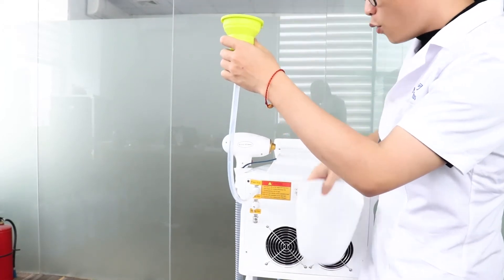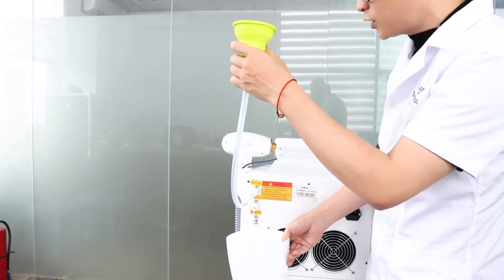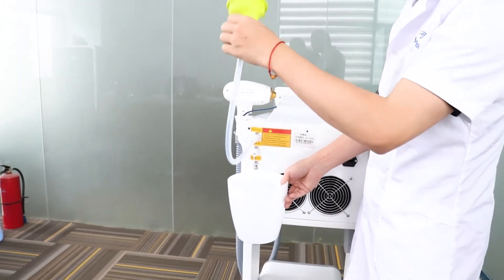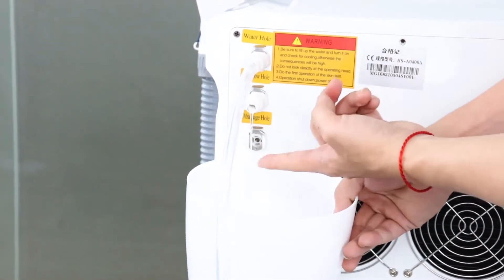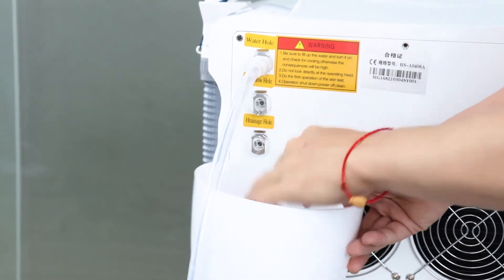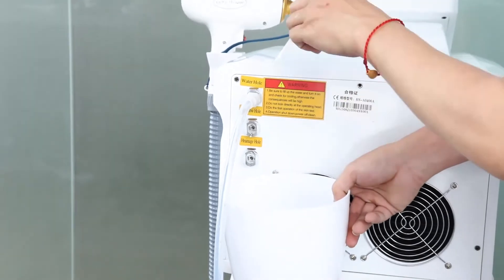At the overflow hole, you will see water coming out. That means inside the water tank is full enough. So now we can stop and remove the funnel — don't need to add water again, because overflow water is coming out. Remove the overflow hole connector, and you can keep the funnel connector for now.